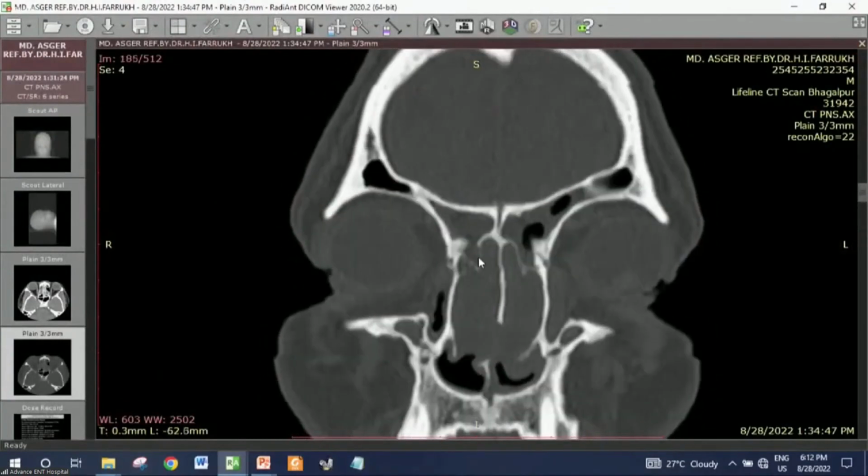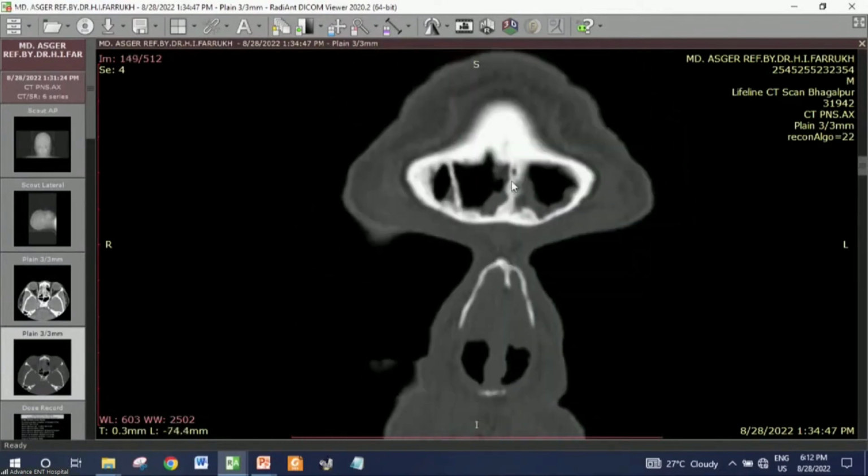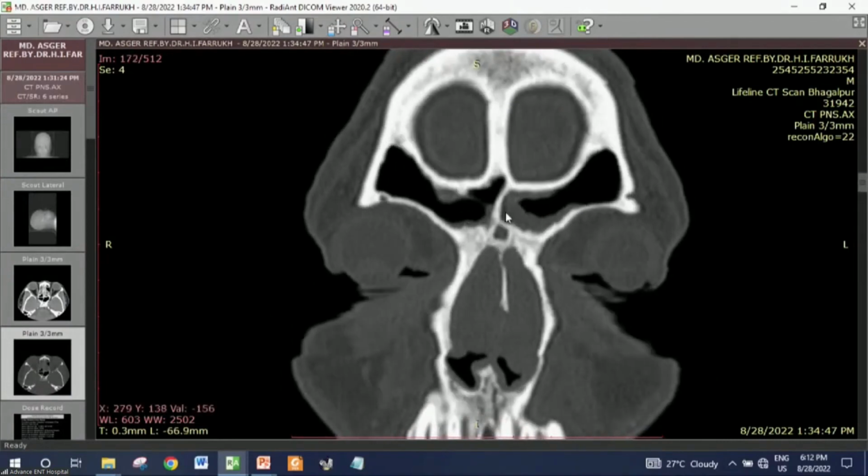Good evening. Sir, this is a very interesting situation, before we close this workshop, to add to the variety of what we have seen during the last 2 days in the frontal sinus. This patient, see this. That is the frontal sinuses on both sides.